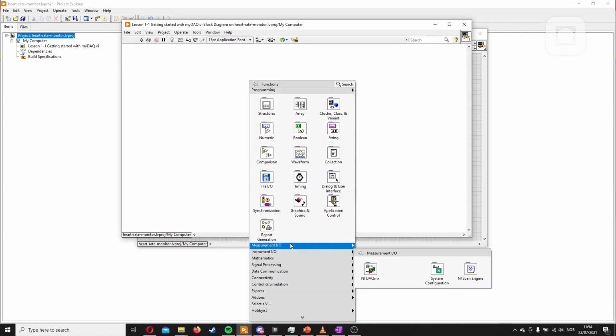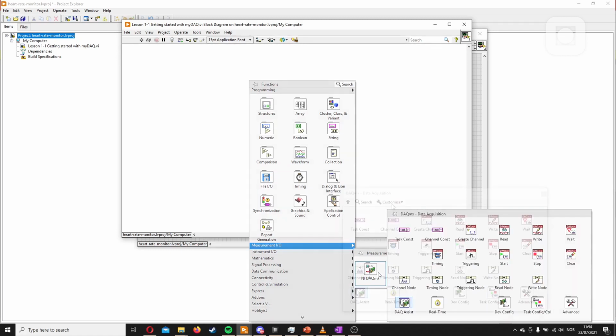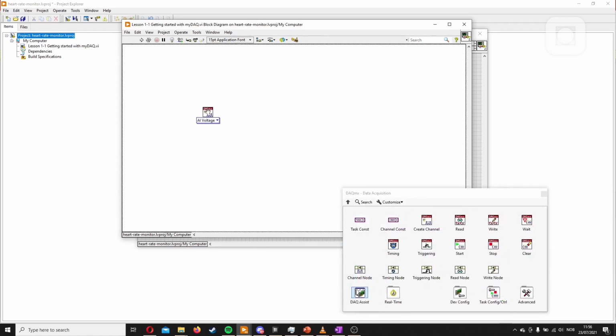Find the DAQ-MX VIs. First thing we'll do is to put the create channel VI. This is to reserve the resource, which is the MyDAQ, which we will need. Then we will configure the timing with this VI. I'll go into the details of each VI later. I'll just place all of them out now.